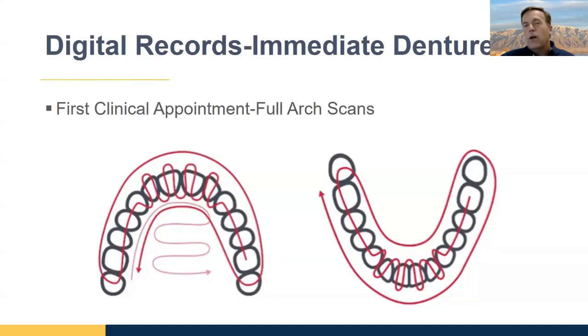We'll talk about that a little later on, but that's part of communicating with your patient about dentures, is that it's not a one and done thing. You'll need to do maintenance because their mouth will continue to change.